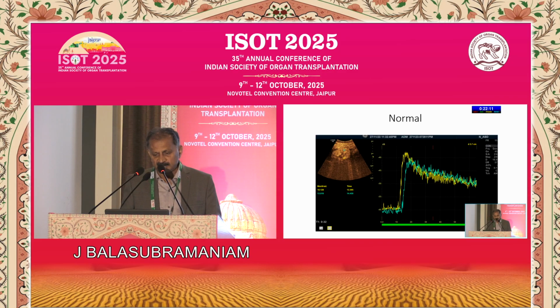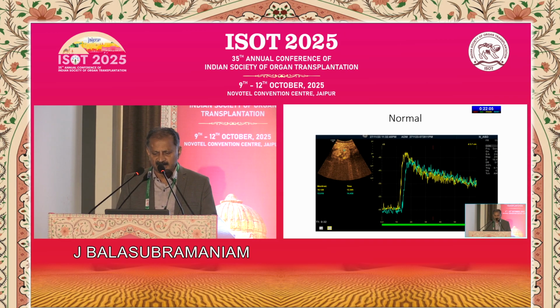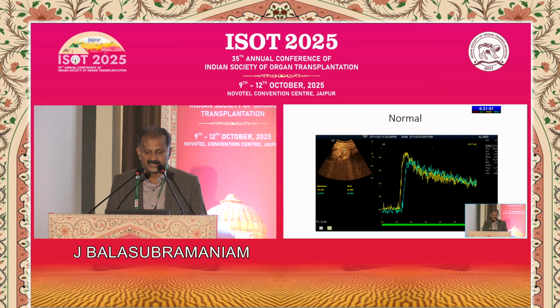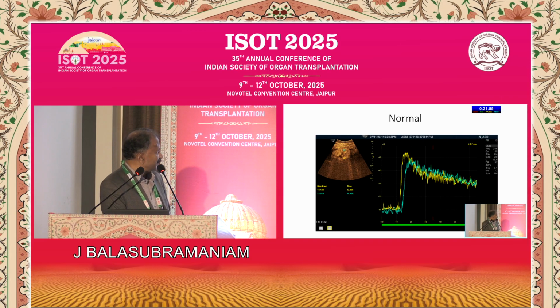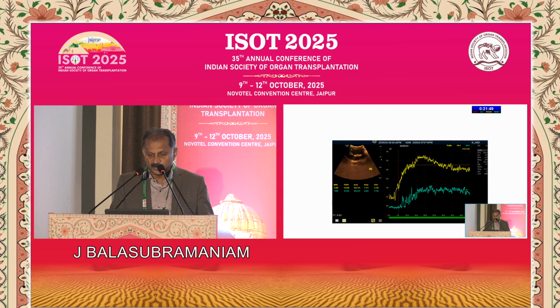And if you see a pattern, normally they happen simultaneously and the pattern is similar, one lies over the other, but whether there is separation of these graphs, or the rate at which the peak inflow goes and the decay comes, these things may be able to tell us something more.